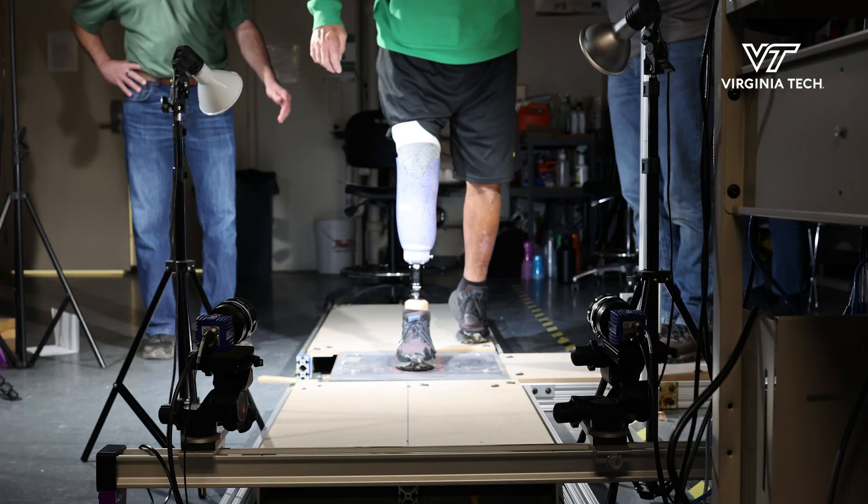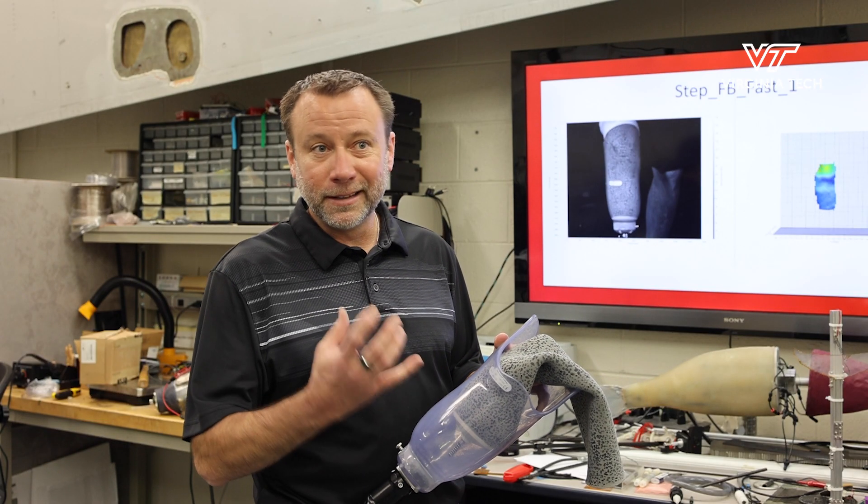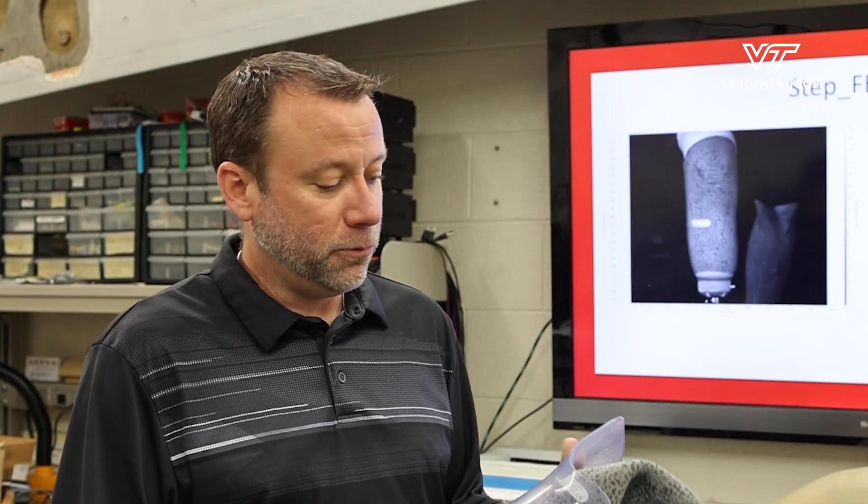Part of the research we're trying to do is look at what's going on inside the prosthetic socket. We've been applying some new engineering tools for measuring the strain or the deformation of the liner, which is related to the deformation of the residual limb.